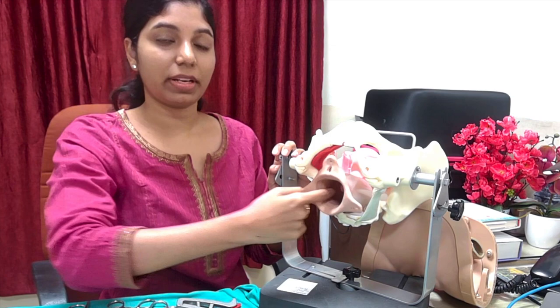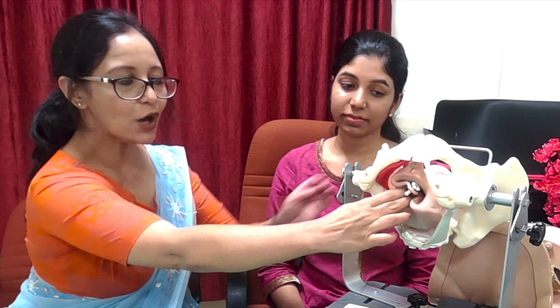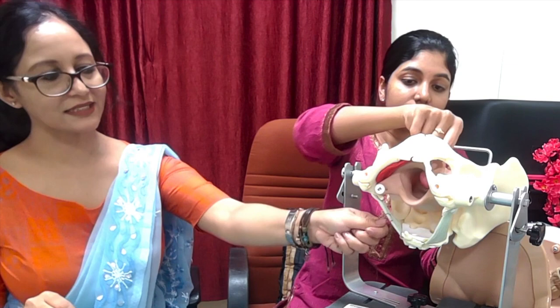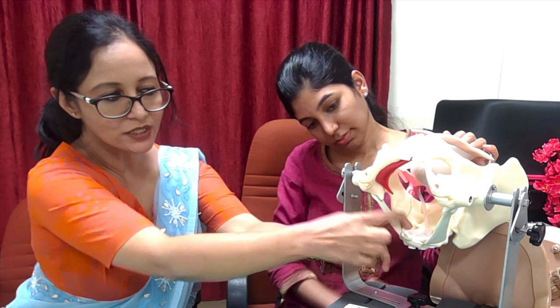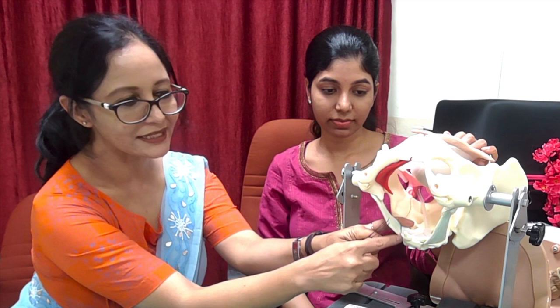The model demonstrates beautifully how the sacrospinous ligament runs — in the dorsal position it is more or less straight, arising from the ischial spine and inserting at the sacrum. You take two bites approximately two centimeters from the ischial spine — one lateral and one medial — which are then fixed to the vaginal vault. If done properly, the entire procedure takes only 10 to 15 minutes.